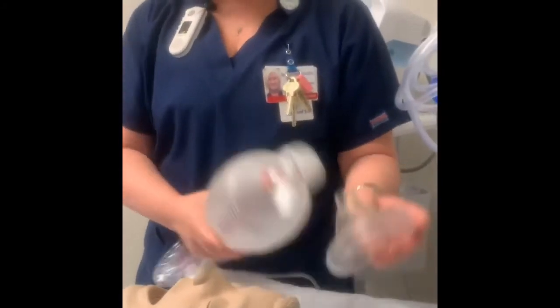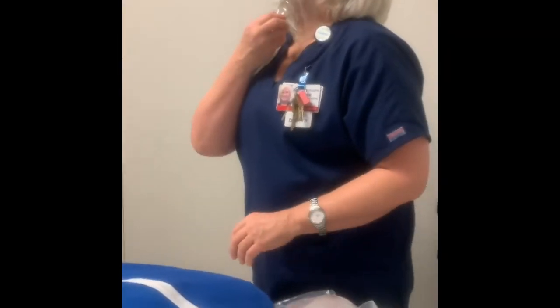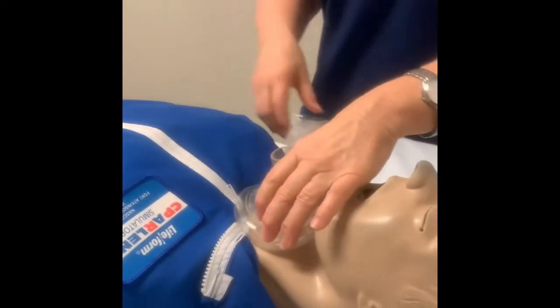Thank you. Yep, so, I don't have a pediatric mask, so if I were to use this on me, do you see how I'm not gonna get it? I don't care if you put my head all the way back, you're not gonna get a good seal. That's why we have to use a pediatric mask. So I don't have one here, we only have a couple at Gateway, and then I'm gonna ventilate them here.